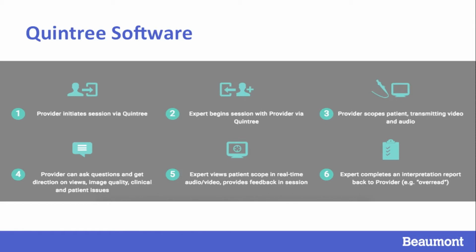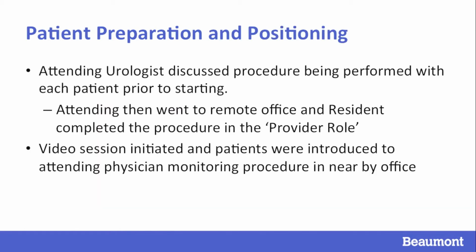The provider first initiates the session with an invitation then sent to the expert logged on in a remote location. The expert monitors in real time as the provider completes a cystoscopy. In our clinic, procedures were performed by first discussing the use of remote technology with the patient. The attending then went to a remote office to assume the expert role, while the resident remained at the bedside to complete the procedure as the provider.